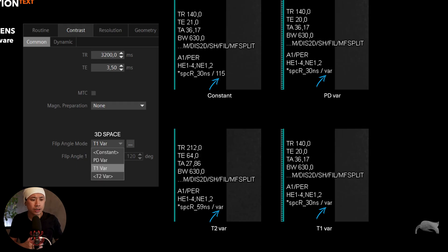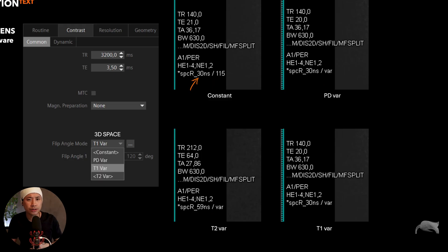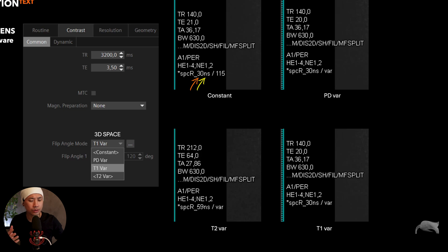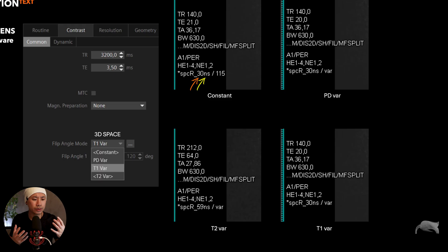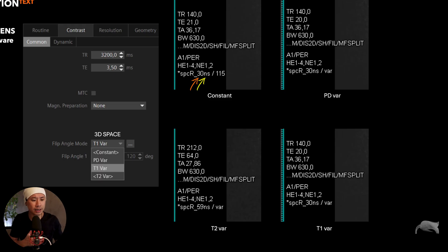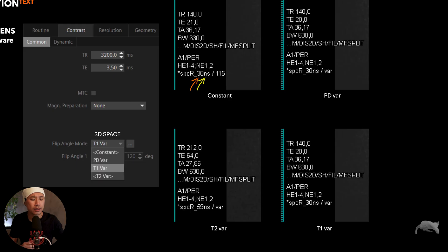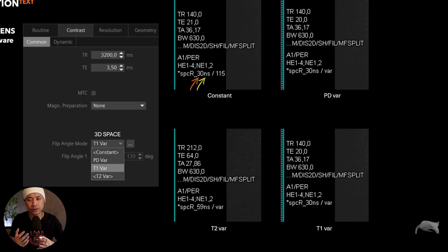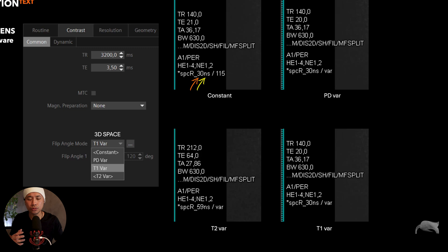However, on the variation mode it just says 'var', 'var', and 'var' - difficult to tell if it's a T1, a PD, or T2. So let me show you here, this is how it was. So it's more or less the same in the tag name. We were using echo train of 30, it's extra information right here which I'm gonna talk about soon. But it doesn't say anything if it's T2 or T1 or PD. However, if you want to have a better understanding without looking at this, you can see the differences because a T2 var would have a different TR and TE, PD would have a different TR and TE, and again T1. But in this case where I was just trying to scan fast just to get the tags right here to show you, it's very very difficult to tell. So there's no way you can say it's a T1 or PD or T2 without the proper information.